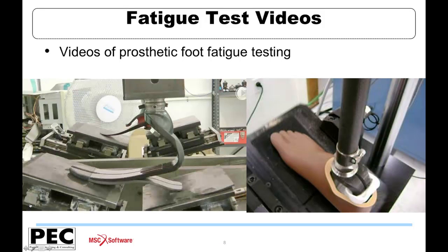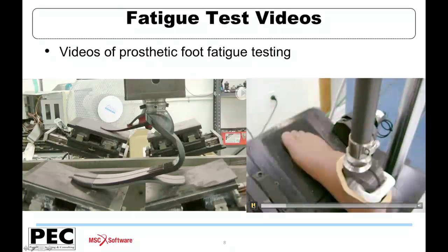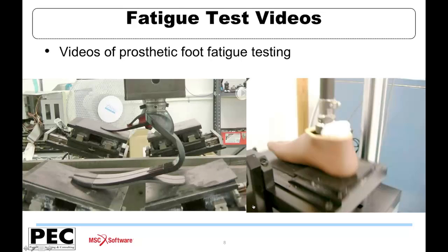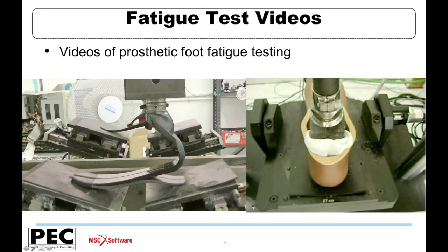So this one on the left is more of an alternating vertical motion then, alternating from toe to foot, toe to heel for the contact. And then here's another aspect of fatigue testing, more of a rolling contact. So you see here the platform is pivoting and making contact with the heel and then rolling through to progressive contact up on the toe.